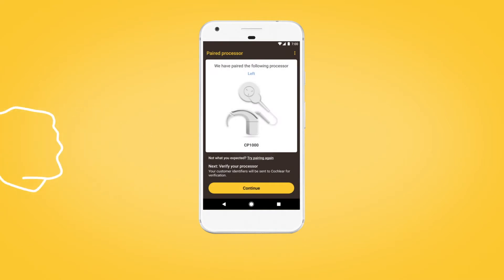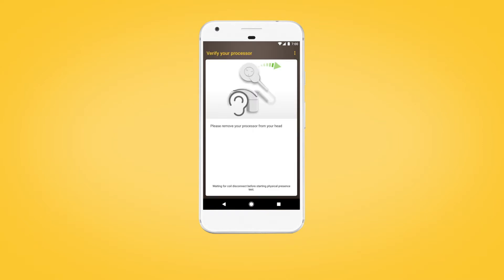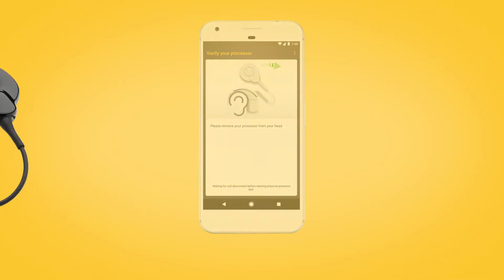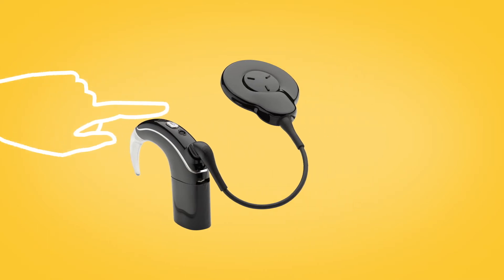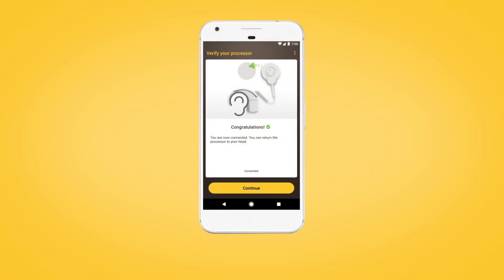The next step is to verify your sound processor. Tap Continue, then remove your processor from your head. Briefly press the button on your processor, then return the processor to your head when prompted.